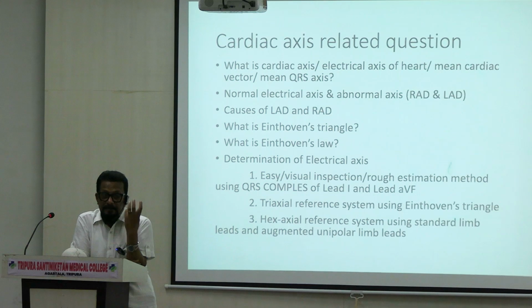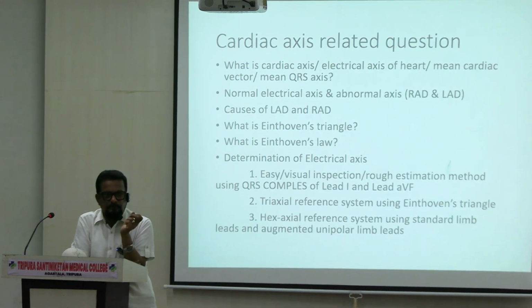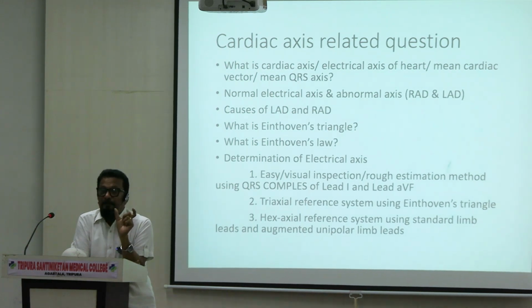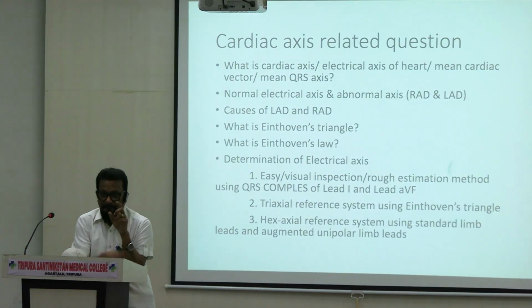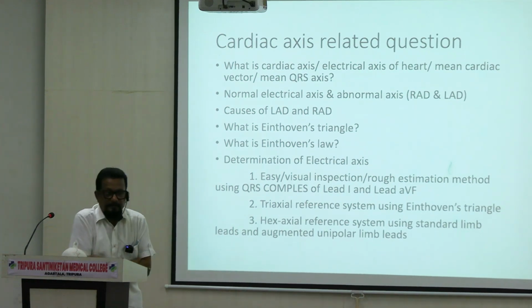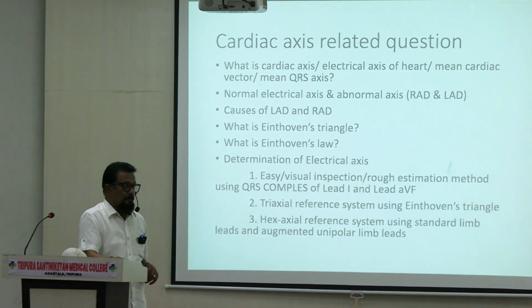And electrocardiograph is the machine. I asked this in a biology examination, but most of the students couldn't answer properly. Electrocardiograph is the machine by which we take the record. Okay, and electrocardiogram is the recording, the tracing we obtain, with the different wave patterns. This is the electrocardiogram, not the graph. Okay, be sure about this.